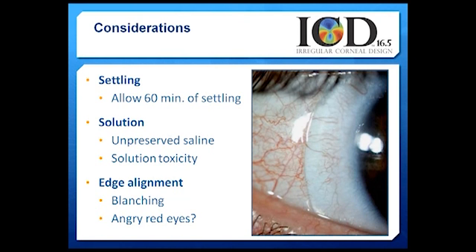The upside of scleral lenses is that almost all patients will report that these lenses have the comfort of soft lenses. And in fact, that's what we see them report on comfort scales. Patients who first wear a scleral lens will report an 8 out of 10 on a comfort scale, similar to first-time soft lens wearers who would say that their soft lens is an 8 on a 10 scale, where 1 would be very uncomfortable and 10 would be very comfortable.